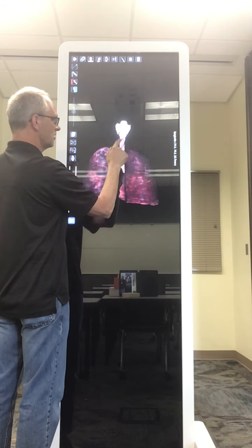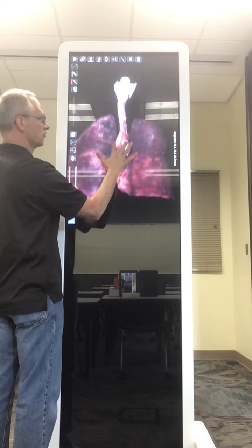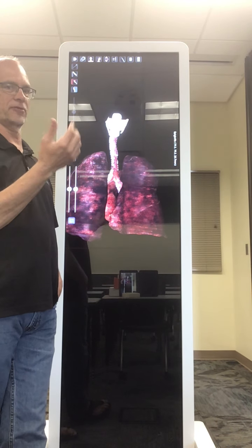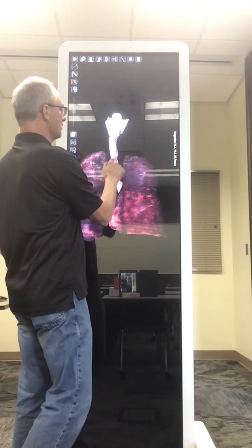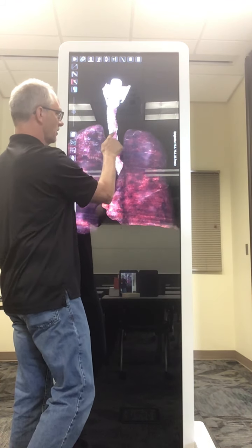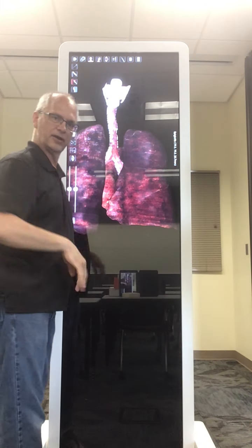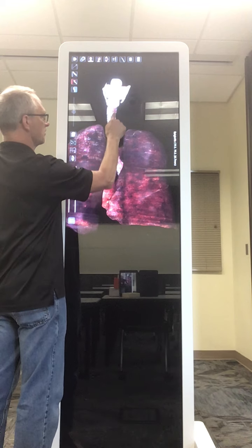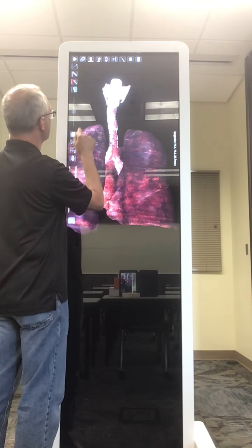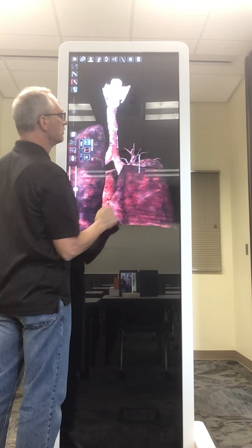So then we can see this trachea comes down here. On the back side of the trachea, you can see there's kind of a groove there. That's where there's no cartilage ring. It doesn't go all the way around. And that little groove there, I don't know if you can see it in the video, but we can see it here. There's a groove there where the esophagus will sit. It seems to be a little bit too bright on there and washed out, but this is where the esophagus would be.